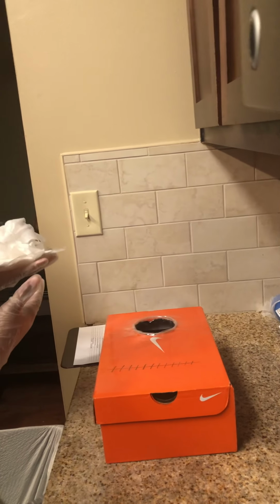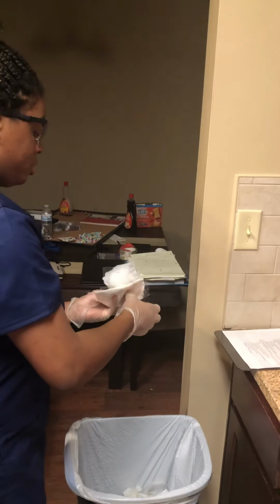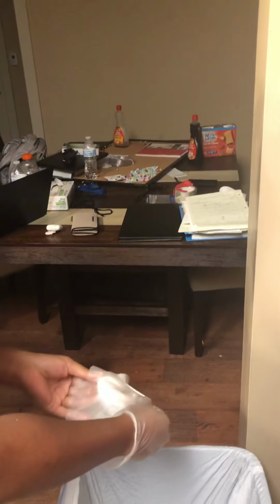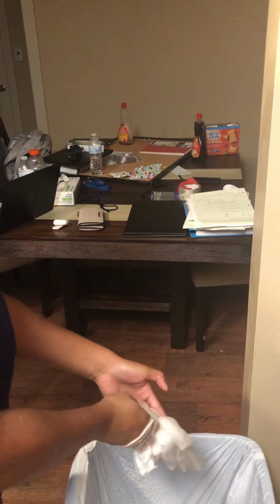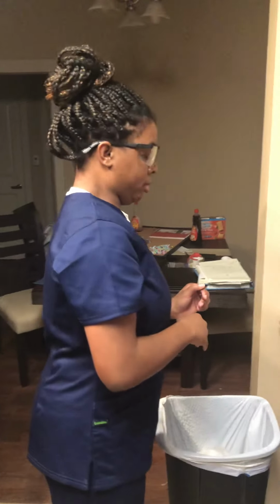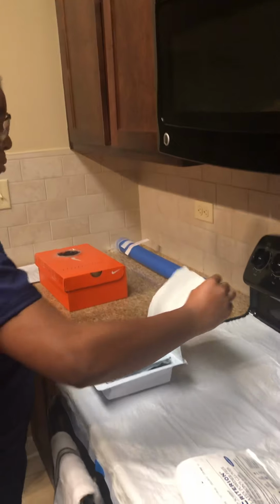I will now discard the wound dressing while folding the inside of my glove, and now removing the glove using glove to glove technique and skin to skin. I will now open my dressing change tray, opening it away from me.